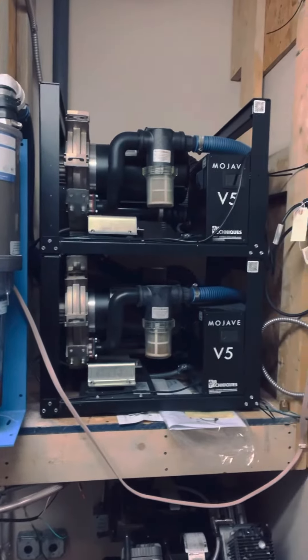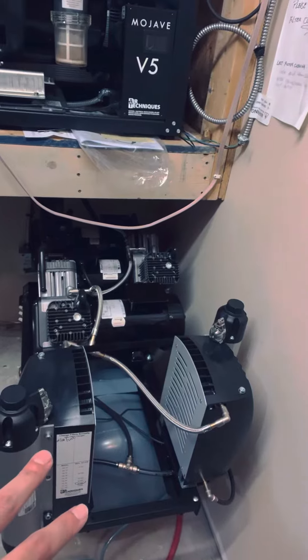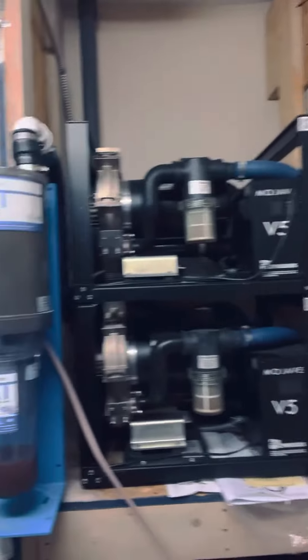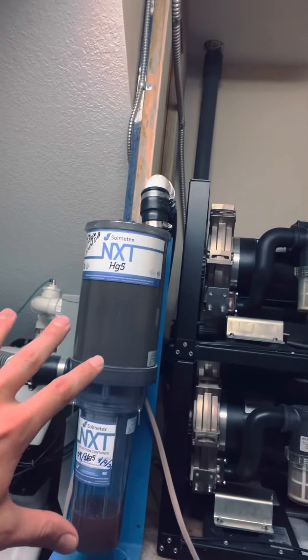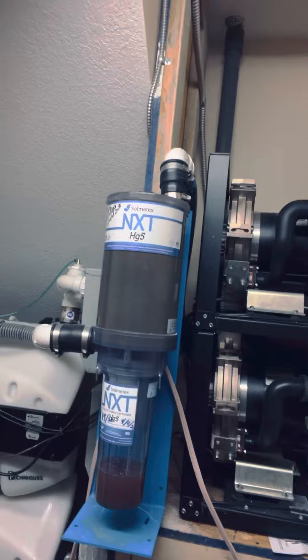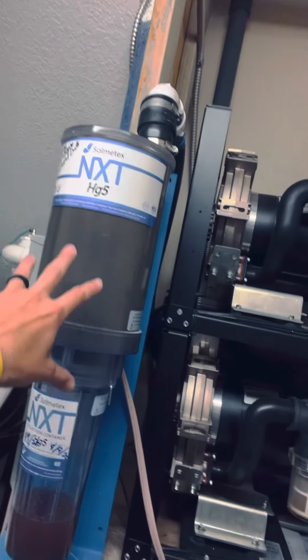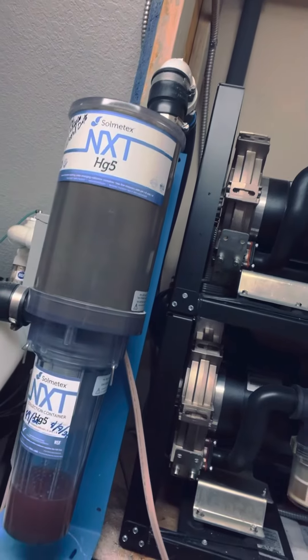Here we go — this is our mechanical room in Peru. Here is our compressor, which gives us all the power to our hand pieces. And then that's our big vacuum unit. As you can see, this is the amalgam separator that hooks up to our vacuum, which provides the suction.